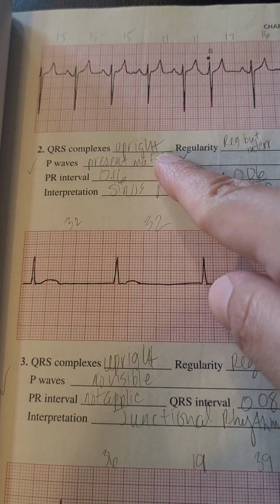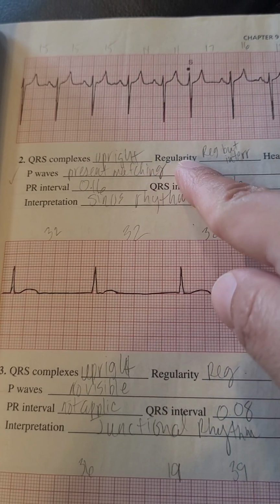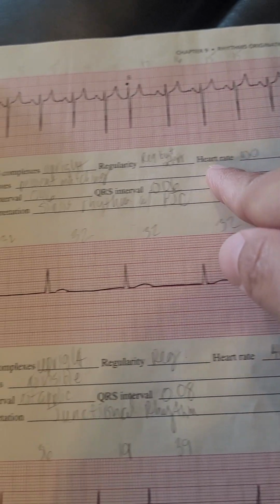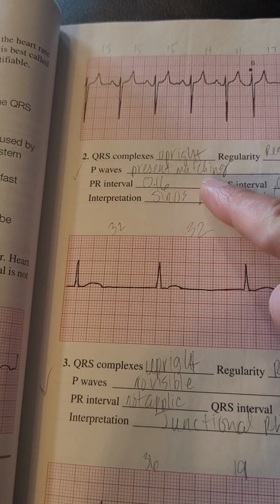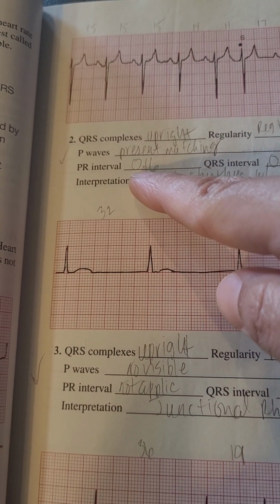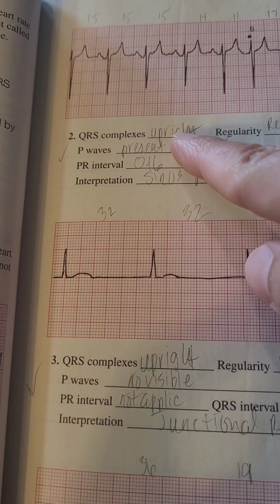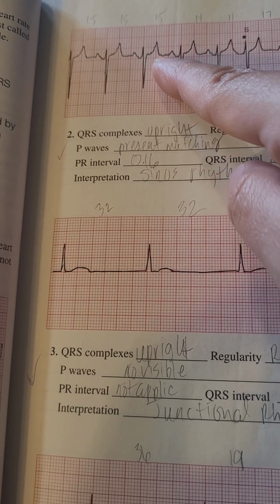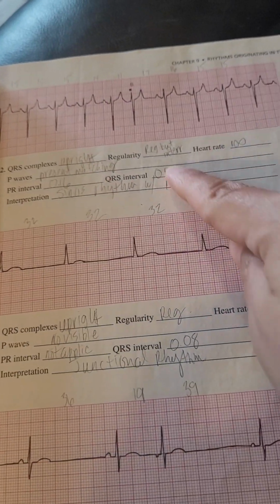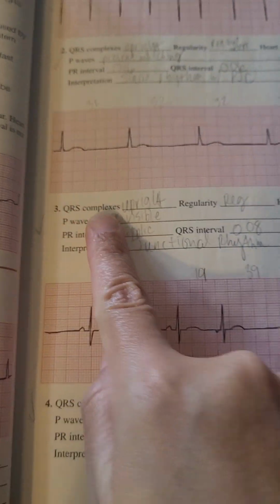The QRSs are upright. Regularity is regular but interrupted. Heart rate. Okay, so it just wants you to fill in the blanks here. PR interval 0.16. So the underlying rhythm is good. It's just that PJC.